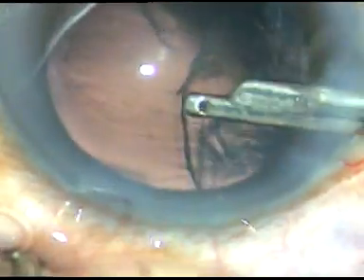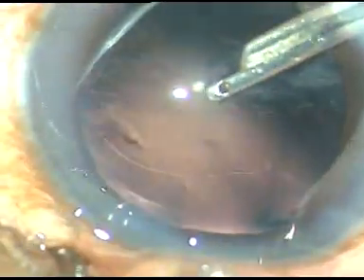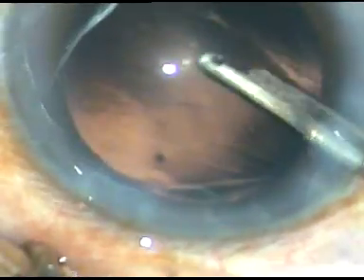Now cortical cleanup is being done. A bimanual IA can be used, but I am using a Simcoe cannula. The side ports are 1.4 millimeter in diameter and the 23-gauge Simcoe cannula goes through them very easily.